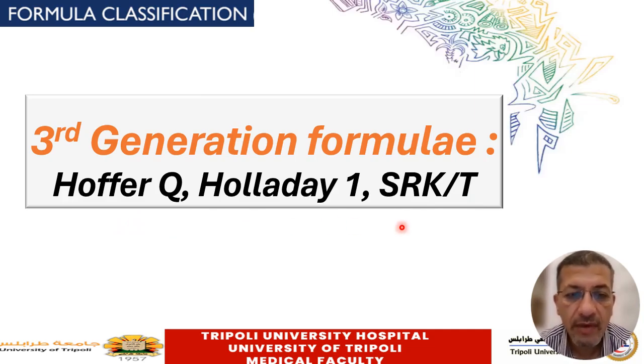All of them belong to the vergence formulas, using thin lens optics along with a regression analysis. And SRK/T refers to the theoretical formula.